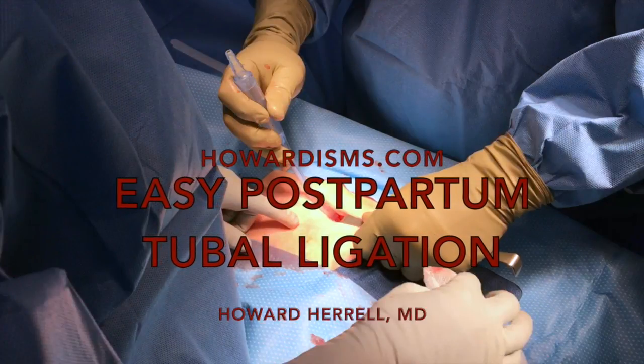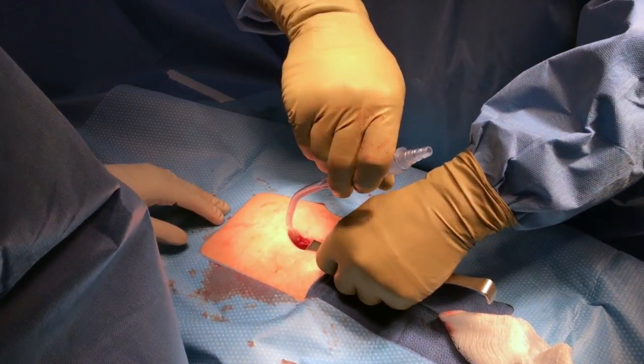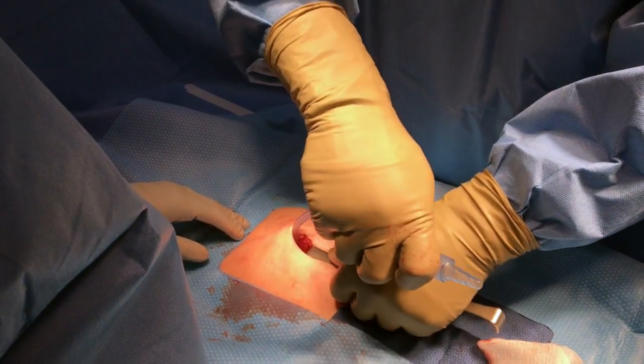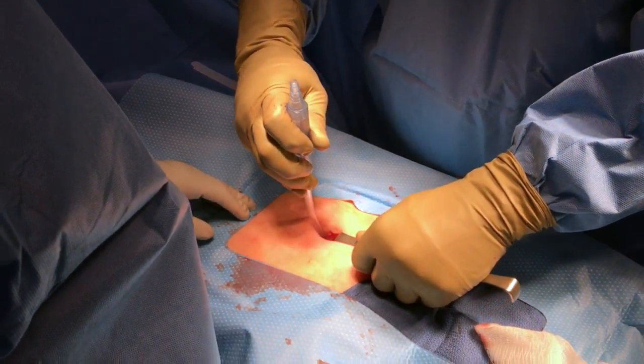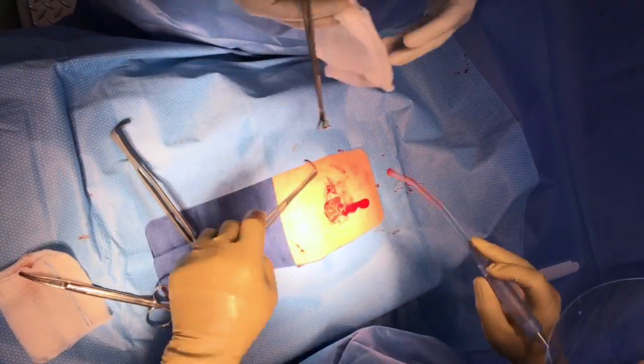Postpartum tubals are made easier with a couple of tricks, one of which is using a suction irrigator as a method of elevating the tube through a small incision. You can use the tip of the suction irrigator to pass it behind the uterus and then elevate the tube on the tip, making it easily grabbable with a Babcock clamp.